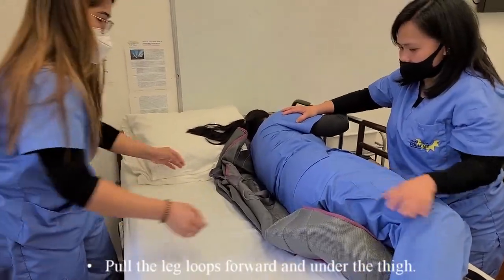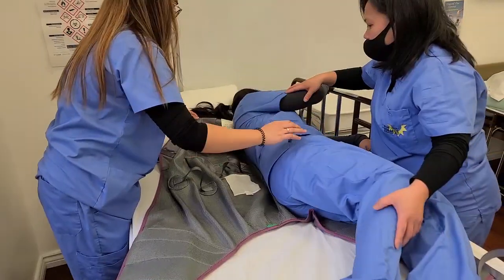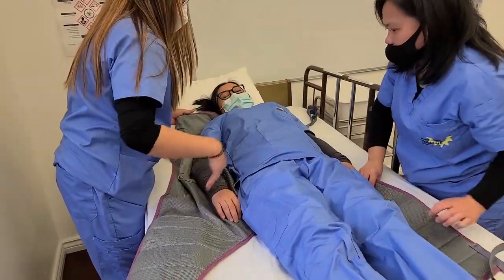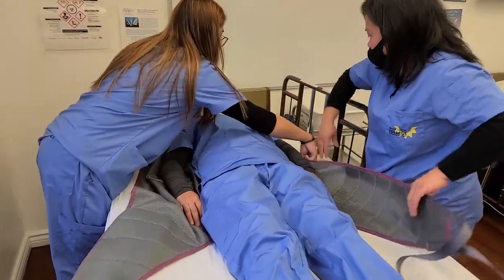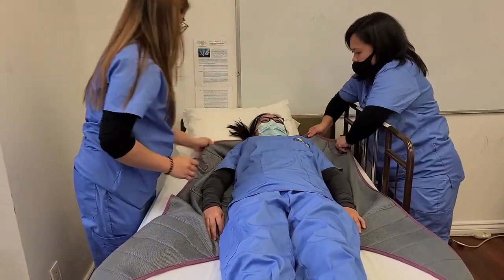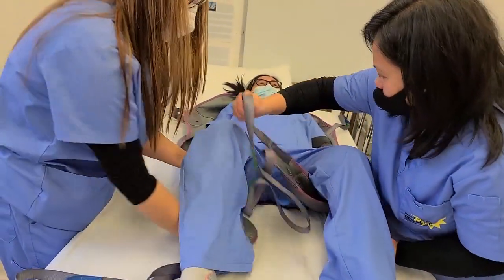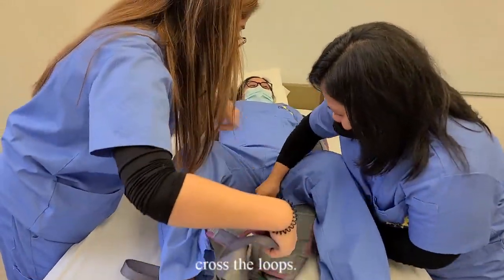Pull the leg loops forward and under the thigh. Cross the loops.